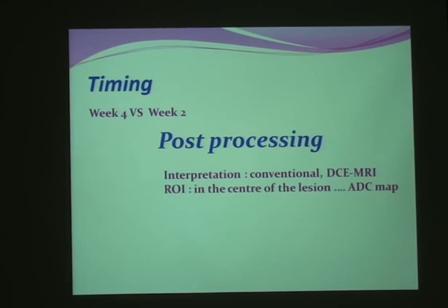So what is the dilemma about week 4 in the menstrual cycle? It's just that I need high ADC value in breast tissues, so if there's a lesion with low ADC value, I can easily detect it. The breast contains as much water as possible in week 4, or a few days after the menstrual cycle reach the peak.